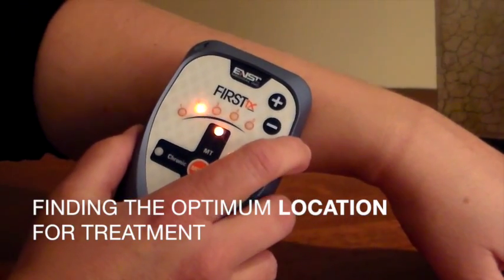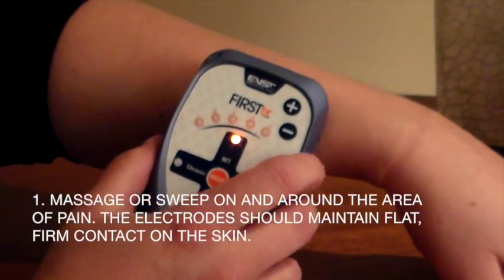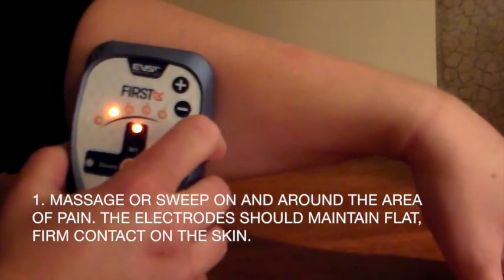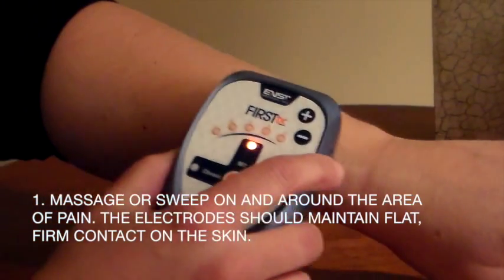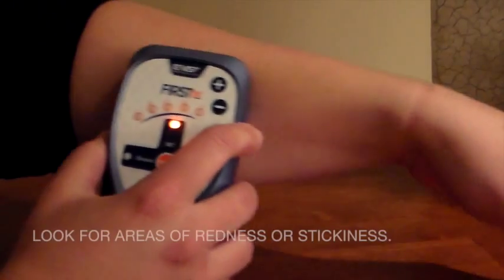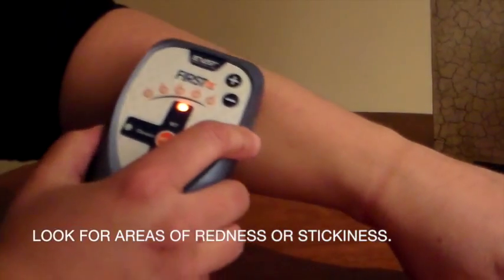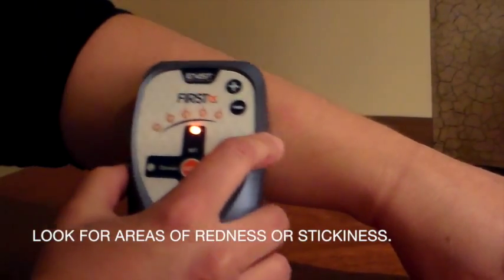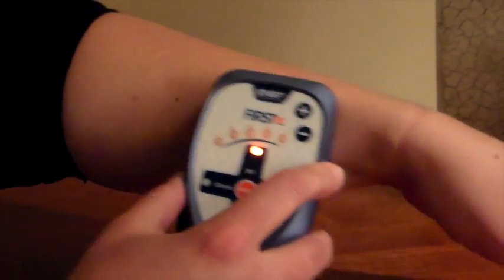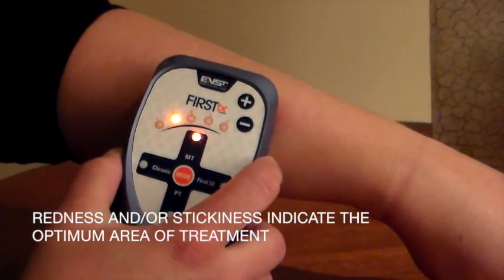Now we want to find the optimum location for treatment. There are two ways to do that. First, use a massaging or sweeping motion on and around the area of pain. Make sure that the electrodes maintain flat, firm contact with the skin as you do this. You are looking for areas of redness that might appear, and you're feeling for a stickiness or an area where the electrodes sort of grab the skin, which is due to skin impedance. Redness and skin impedance indicate a good area for treatment.